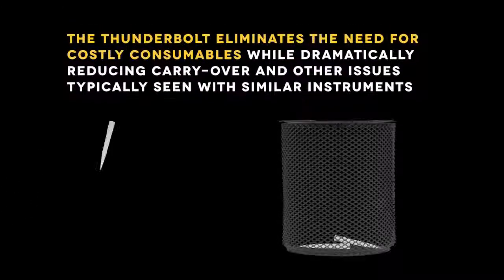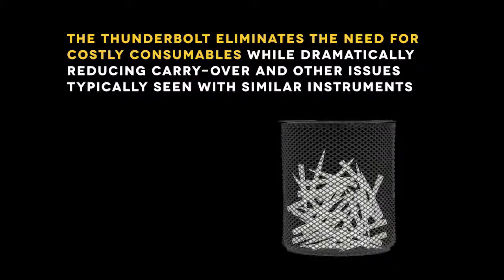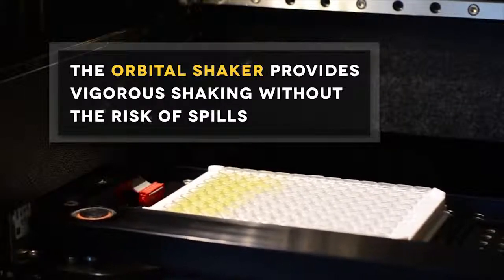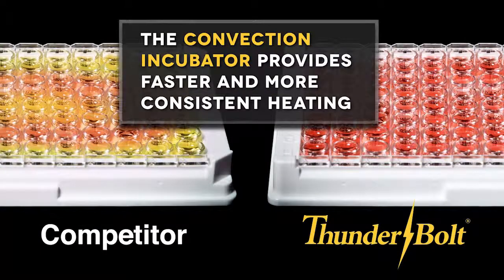The Thunderbolt eliminates the need for costly consumables while dramatically reducing carryover and other issues typically seen with similar instruments. The orbital shaker provides vigorous shaking without the risk of spills. The convection incubator provides faster and more consistent heating than other instruments.